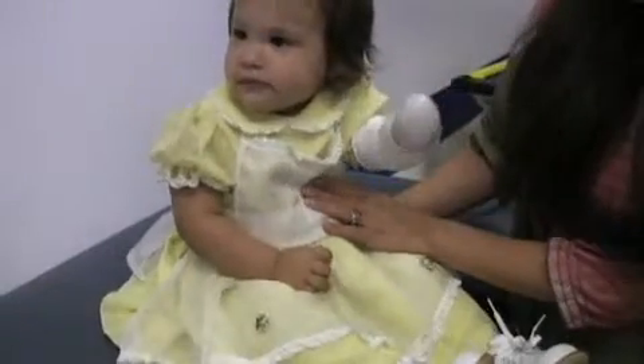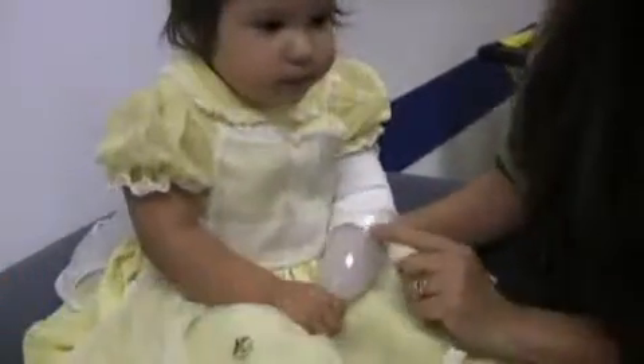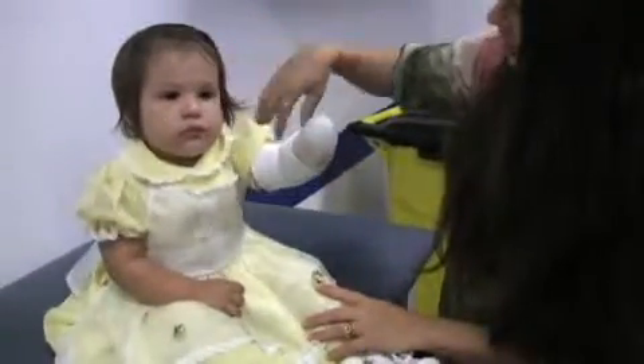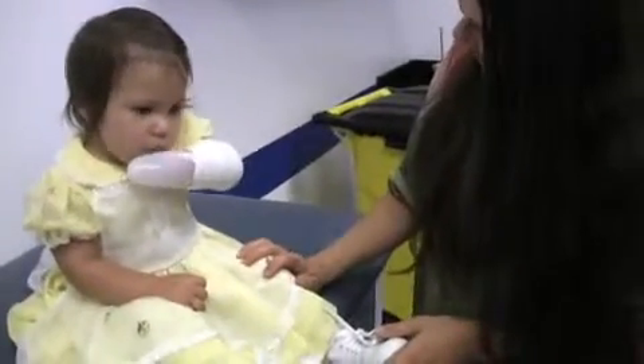She doesn't know that she has a hand. She turns books, she opens doors, she holds bottles, she grabs little things with her left hand — kind of forgets she doesn't have that ability and goes for her right. So it's awesome.